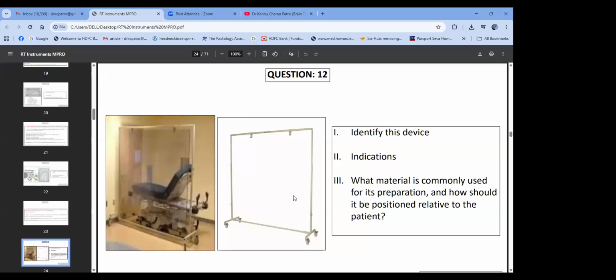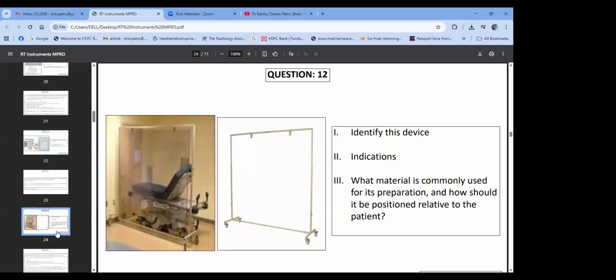So the high energy photon beams usually have a much deeper Dmax. 6 MV Linacs have a 1.5 centimeter Dmax. So to move the dose closer to the skin, we keep the beam spoiler about 10-20 centimeters in front of the patient. So this will give out secondary electrons that will give us a homogeneous dose distribution along the skin. Okay.